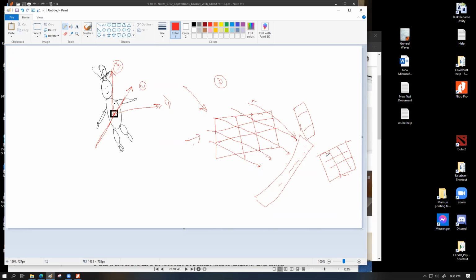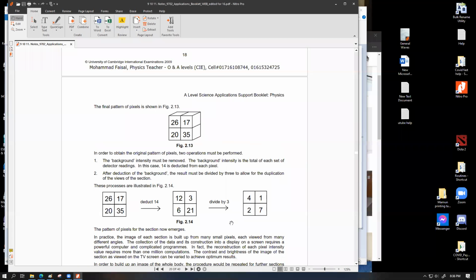So that's big. If you want to work with, let's say, 4 by 4, you're going to have even bigger numbers. With 5 by 5, you have bigger numbers. So the calculation is extremely large for practical purposes. The numbers that we handle in a practical CT scanning process are very large. That's why it is never done by humans, it is done with the computer, and ultimately this leads up to the voxel values, or intensity of the voxels.